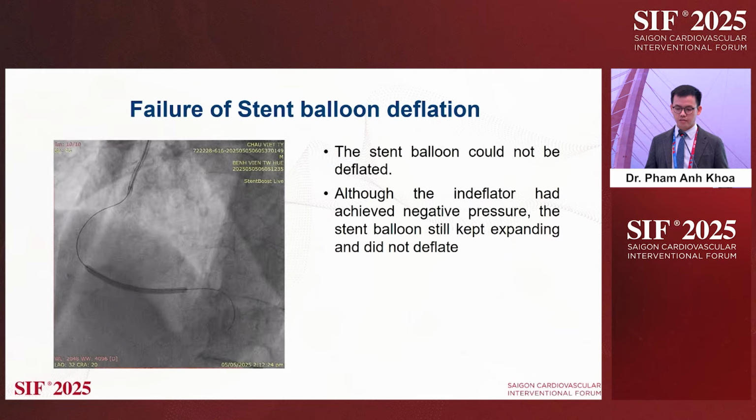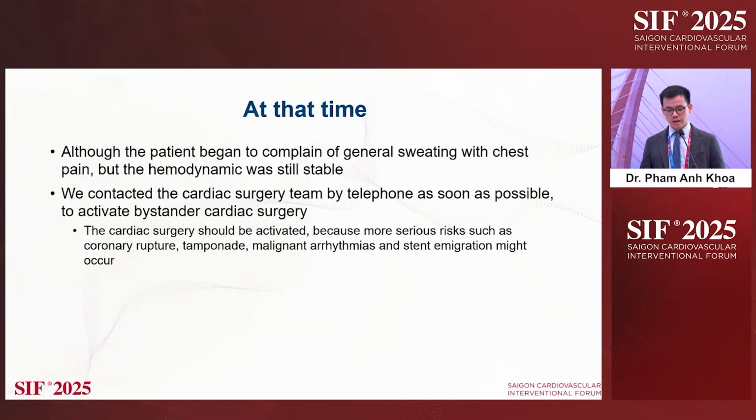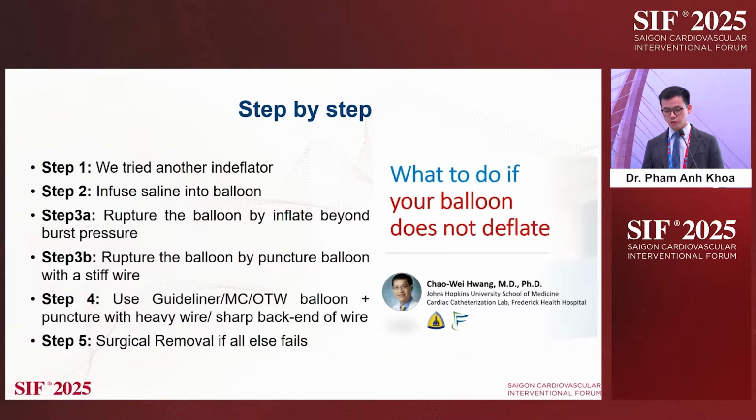So I saw that this was a failure of stent balloon deflation. Although the inflation device achieved negative pressure, the stent balloon kept expanding and did not deflate. And at that time, the patient began to complain of general sweating and chest pain, but the blood pressure was still okay. Because we were a little bit scared, we contacted the cardiac surgeon to be on standby, just in case. So we did it step by step.